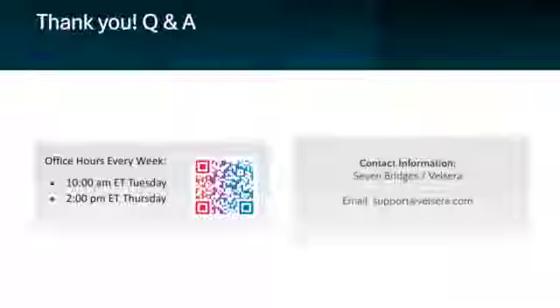It helps researchers connect imaging data with other molecular and potentially clinical data across the Cancer Research Data Commons, or the CRDC as it's called. So whether you're developing new methods, training models, or just trying to visualize something, keep the IDC and Slicer Jupyter, 3D Slicer, in mind, because they really work well together to form a powerful foundation for imaging-based cancer research.